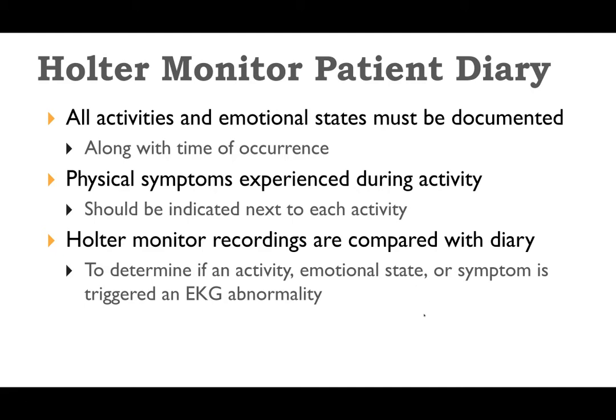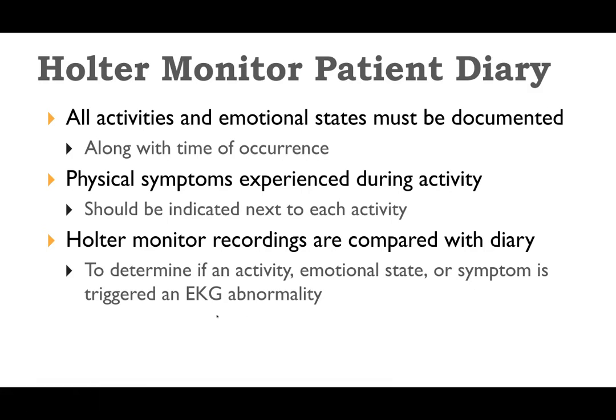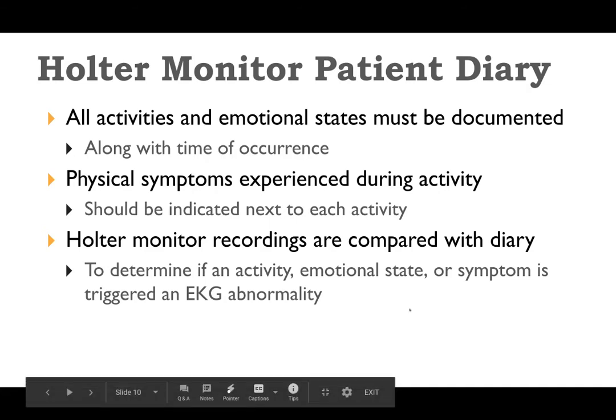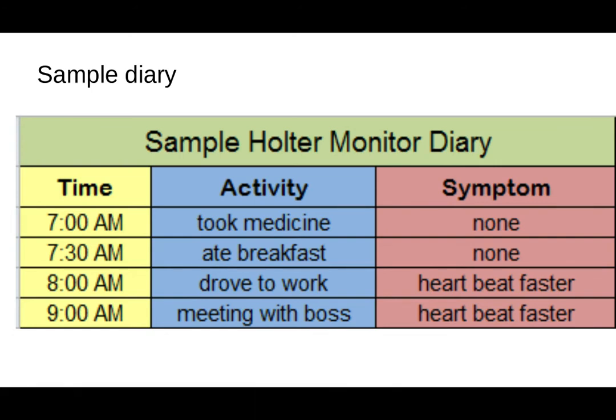It's also very helpful to know if they are not. Oftentimes people will be having symptoms that are unexplained, and you might have a Holter monitor just to rule out any cardiac abnormalities. So that's also very important information to note, and can be very reassuring for a patient that even though they're getting chest pain, there's no abnormalities on their Holter monitor corresponding with that. Now, that doesn't mean necessarily that they're not going to do any further tests, but it can be reassuring sometimes for patients.